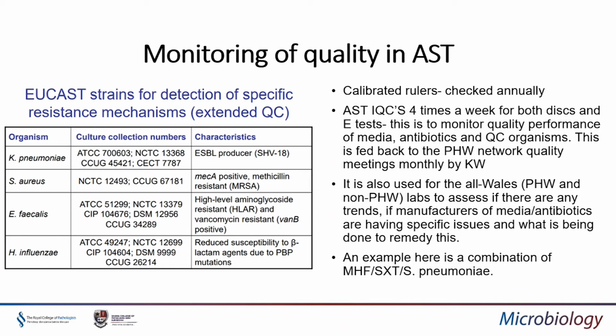I also use this data to inform the All Wales group, which is Public Health Wales and non-Public Health Wales labs. We have a group where we discuss any AST related issues, any media related issues. If we have certain antibiotics or organisms that are trending too high, too low, or we keep getting repeated discrepancies, we can discuss it as all of Wales and decide what to do then. So I take this data to these meetings.